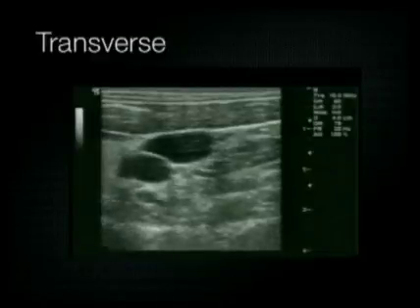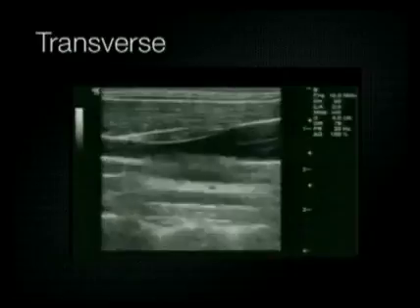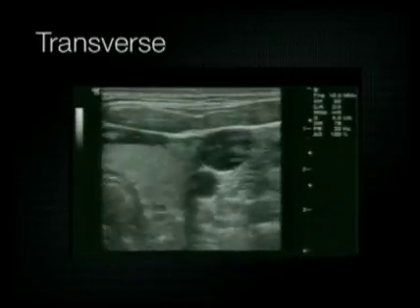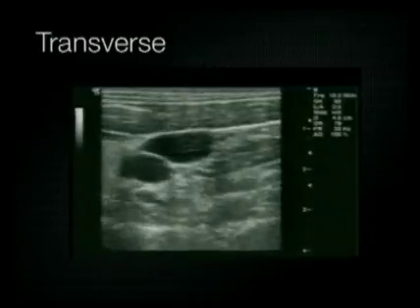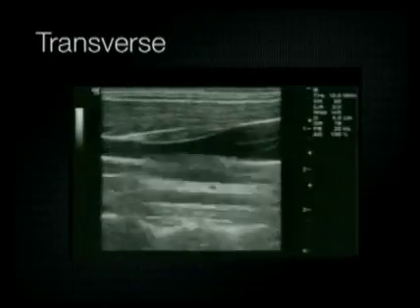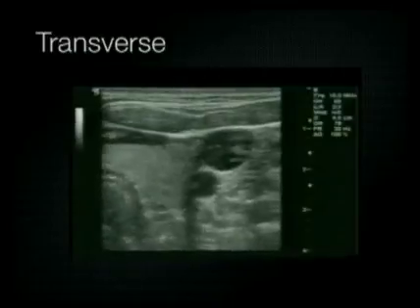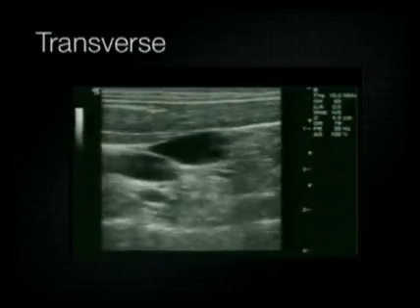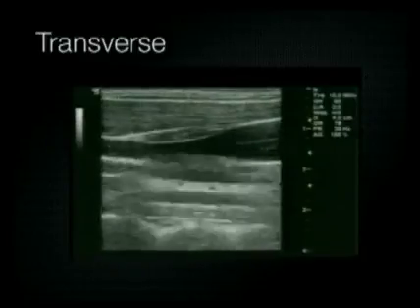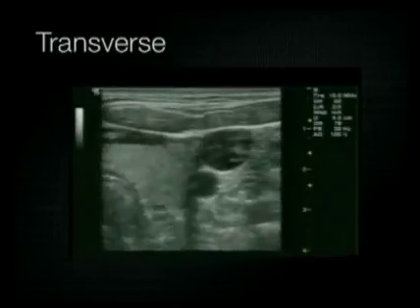With the transverse approach, you can easily visualize the carotid artery next to the internal jugular vein. Here we're showing a transverse view, then switching to longitudinal — and as you can see, once you switch from transverse to longitudinal, the carotid artery falls out of the picture. Because of this, we recommend using the transverse approach to cannulate the internal jugular vein in order to avoid inadvertent carotid artery puncture.